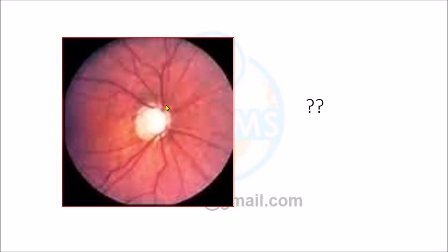And what you are looking at, the vessels, are they coming from the center? No. It seems that the vessels are coming from the periphery. Okay? Just coming out. So what is the underlying diagnosis? Intraocular pressure increased. And any disease? Papilloedema. No. Papilloedema means there will be redness. There will not be cupping like this.